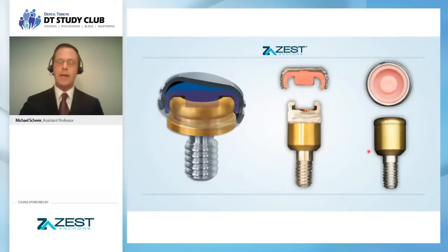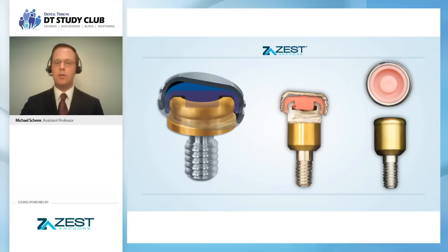So if we look at how a locator functions, a lot of us don't necessarily understand that yes, the locator does tend to snap into place. But what happens when that little snap occurs? Is anything other happening inside of this attachment? Are we concerned about any sort of movement with the denture? Well, a lot of people don't recognize that when a locator attachment snaps into place like you see here, there is a pivoting motion that's occurring. And that pivot is occurring at this little nipple and around the space around the attachment.